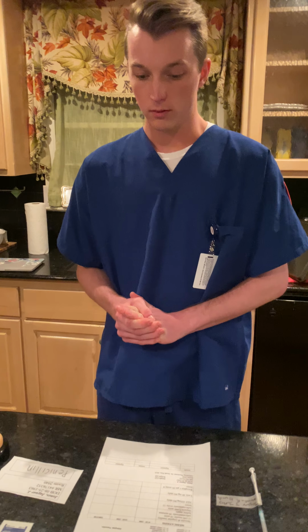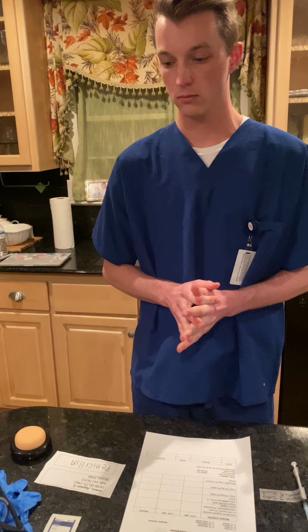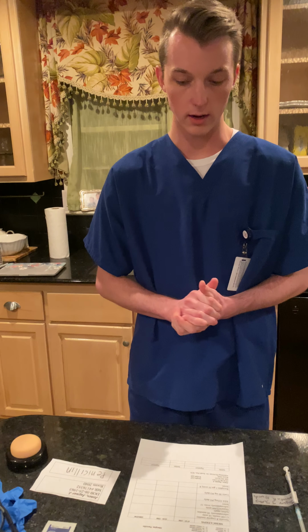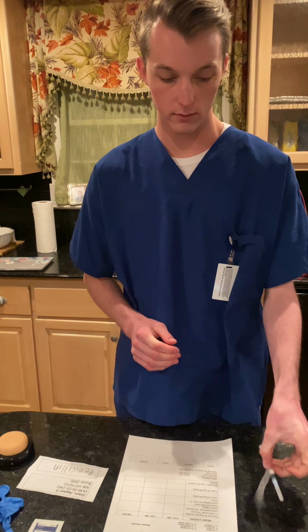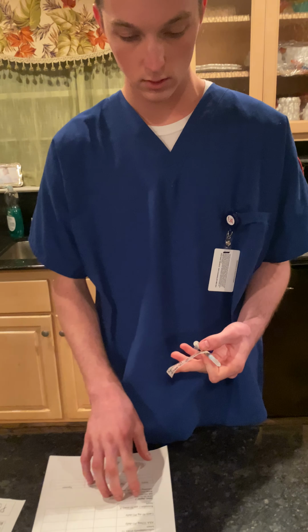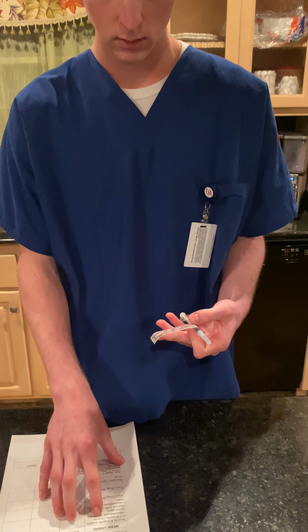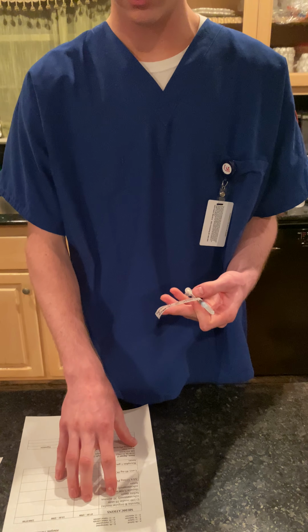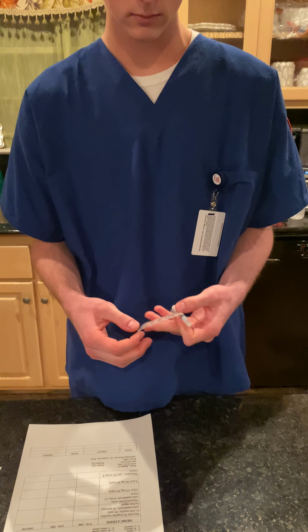So now I will raise the bed, lower the side rails, and get the patient comfortable. And then I will check the 5 rights of medication administration. So I have Jaguar J. Jones, Novolin R regular insulin at 10 units. Will be done subcutaneously, and it is being given 30 minutes before meals.